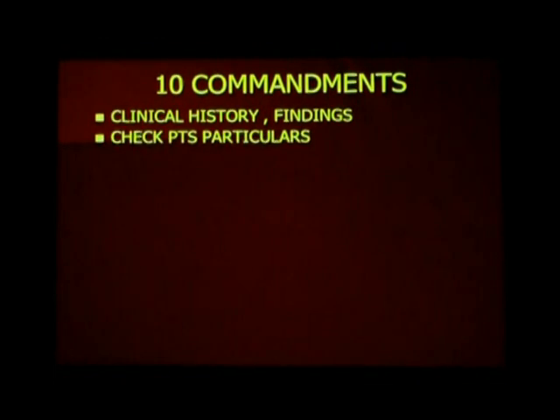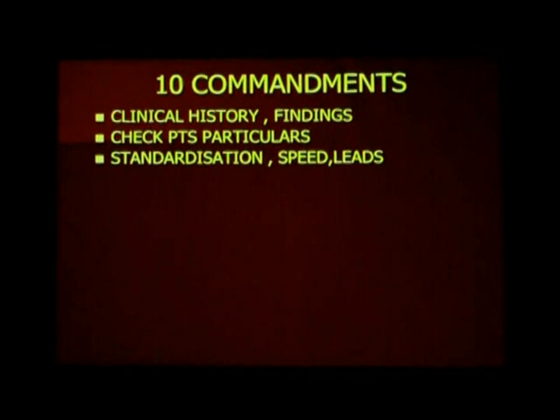Second, always check the patient's particulars. As I told you, make sure the ECG belongs to the patient. Always look at the standardization, speeds, and whether the ECG is recorded properly. Where will you place V3? Between V2 and V4.